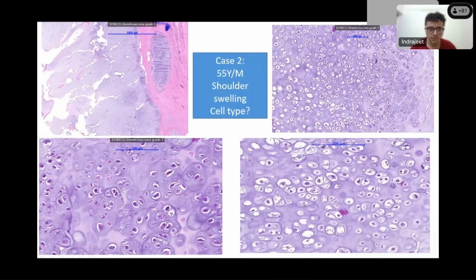Now, what do you think here? Krishna Priya, can you just describe this? Now we just saw how osteoid matrix looked like and how osteoblasts look like. How different is this? What tissue will you call this? And you just heard the radiology.